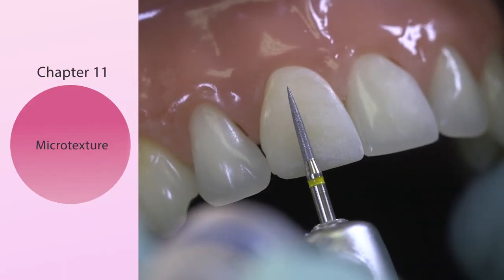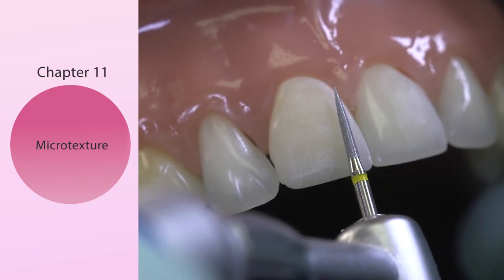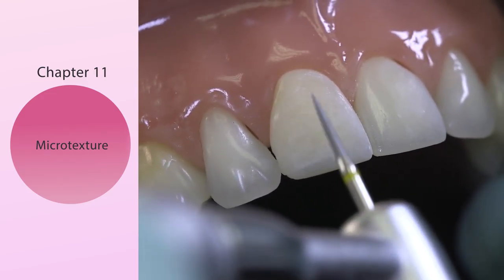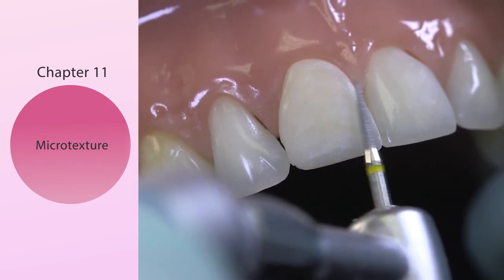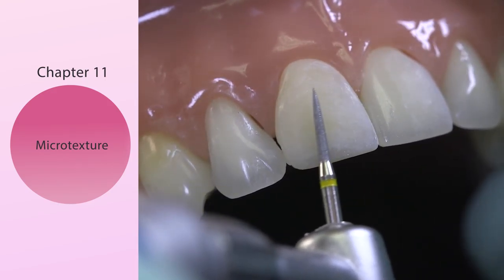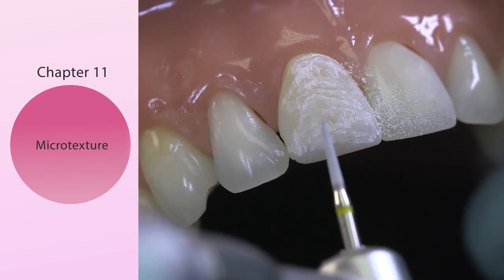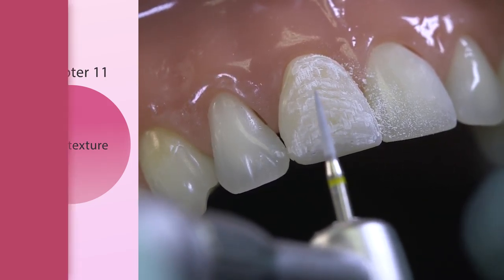In the artistic bur kit is the yellow flame diamond. When I use this, I'm using it dry so I can see the dust off the tooth. What I'm going to do is break the horizontal striations and any sort of reflection, and I'm going to build that in and customize it. This yellow flame diamond really demonstrates that you have indeed a uniform surface that you can start the polishing sequence.